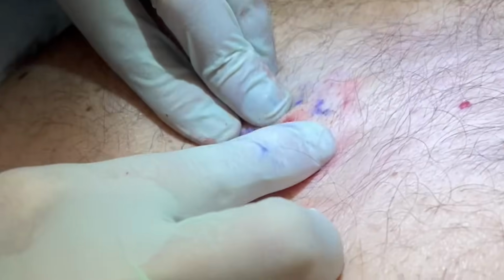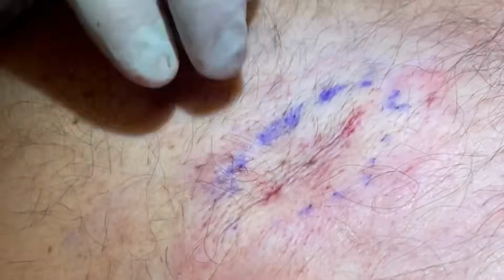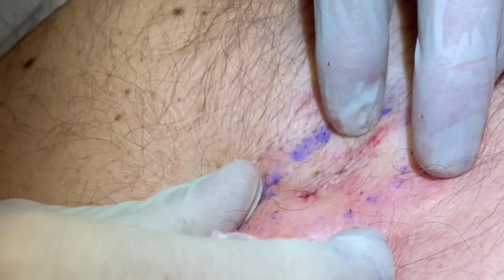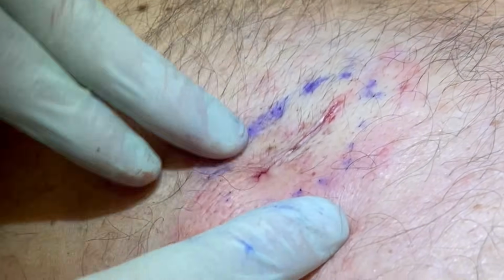Deep sutures, you see that. A good deep suture, you can't even pull it apart at all. It looks like you could just put glue on it, and that'll be good. That's what we do with our subcuticulars. We're going to do a running stitch in there. It's the lower back. He needs extra support. But if that was on the forehead, I'd just put some glue on there. Wouldn't even put stitches in.